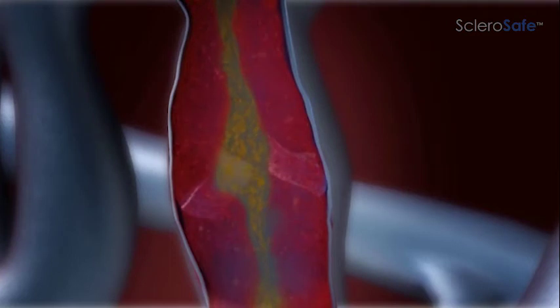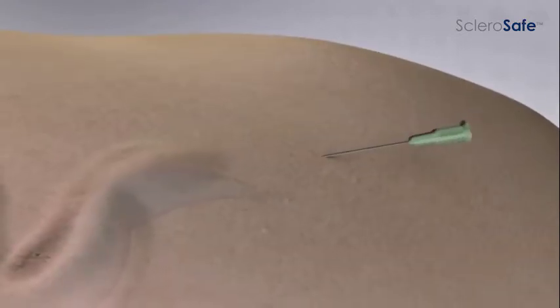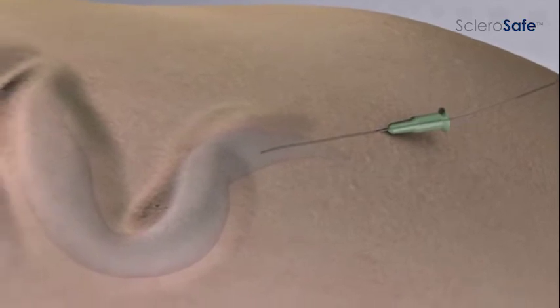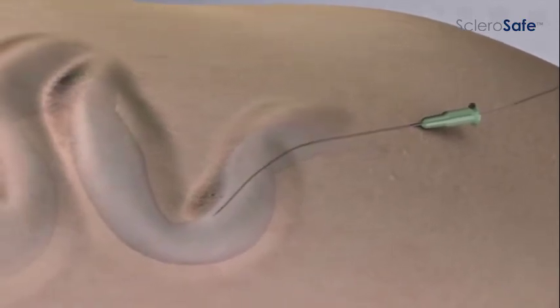Reverse flow in the vein is caused by malfunctioning or incompetent valves. The faulty vein is punctured with a 21-gauge micropuncture needle and a standard 0.018 guide wire is advanced through the vein.